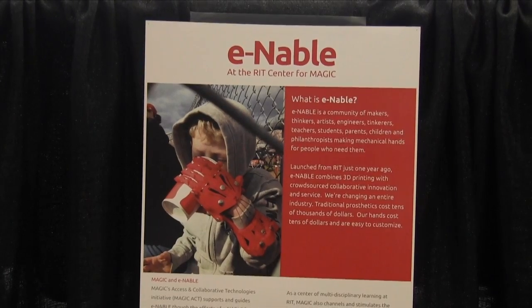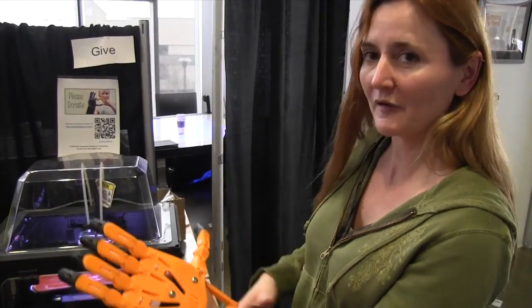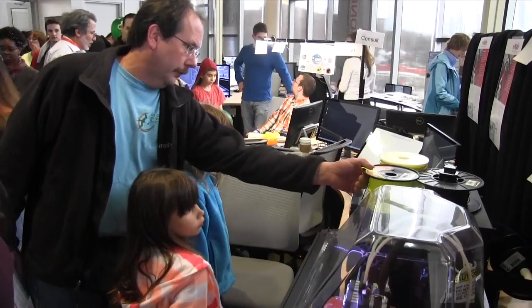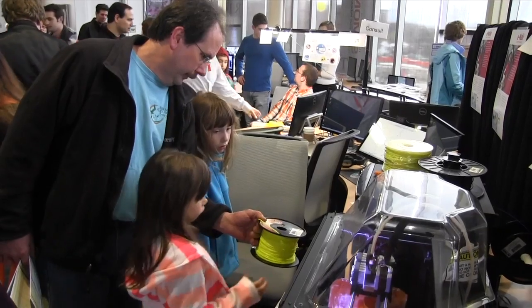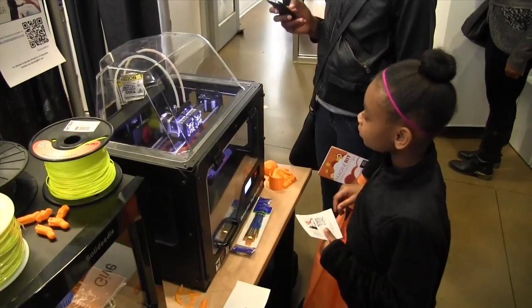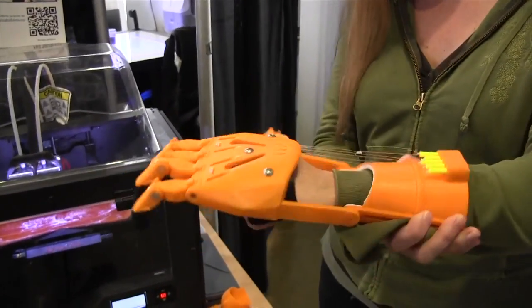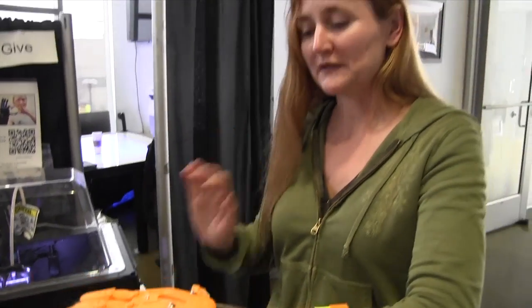e-NABLE is the name of our group. This is a 3D printer — this is a MakerBot. They can print out just about anything. They're kind of like a tube of toothpaste; they layer on top of each other and make a three-dimensional image.